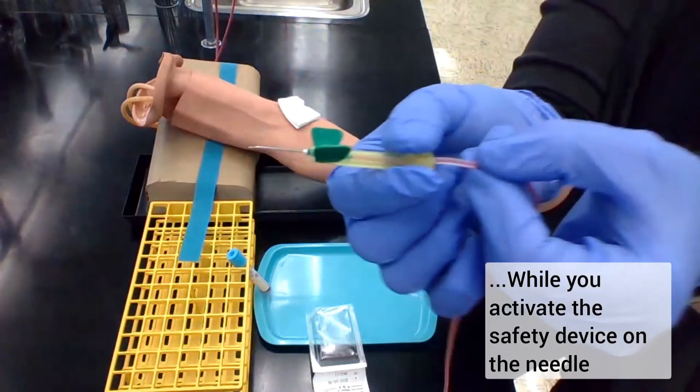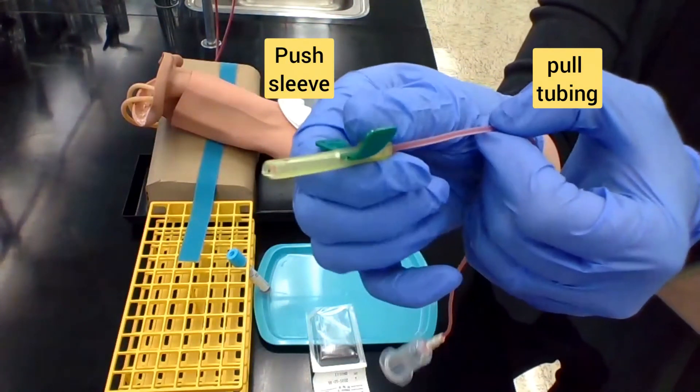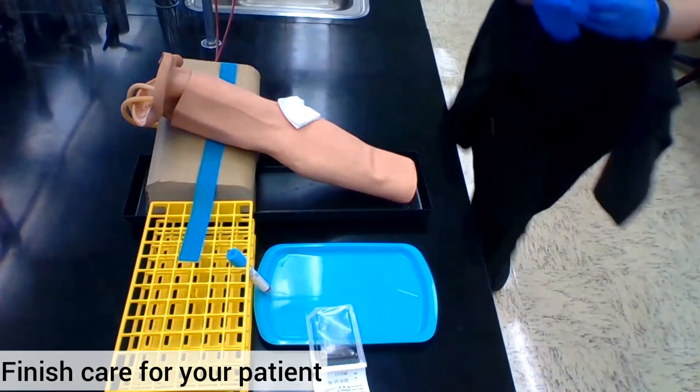Activate your safety device by pulling on the tubing and pushing up on that sleeve. The needle, tube, and holder can all go into the sharps container. Finally, take care of your patient like you normally would.